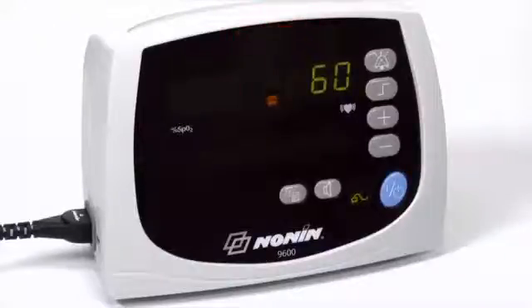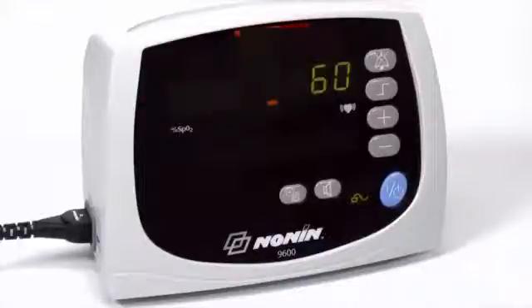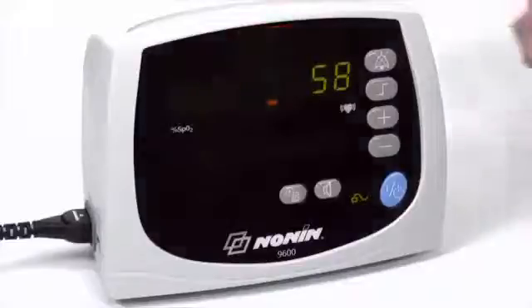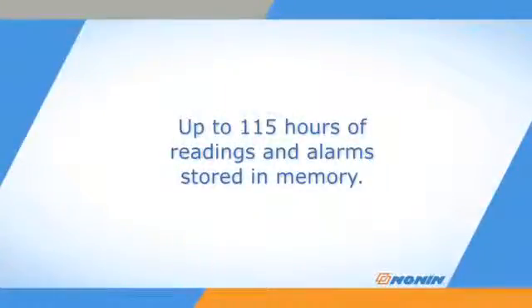Other alarms from the oximeter diagnostics may occur, which will typically generate an error code on the display. You can silence the audible alarm with the alarm silence button. The oximeter will record the time and date of any alarm in its stored data, along with regular oxygen saturation and pulse readings for at least 115 hours of data. It overwrites data when the memory space is full.